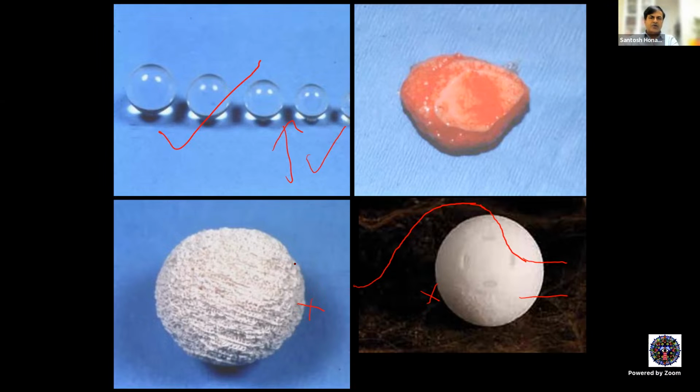Whereas hydroxyapatite and porous polyethylene implants are good for adults who want better implant motility. These two implants provide better implant motility only if the hydroxyapatite implant is pegged, and this is a titanium or a ceramic peg, and porous polyethylene can also be pegged with a titanium peg. Only then do they give better implant prosthesis motility.